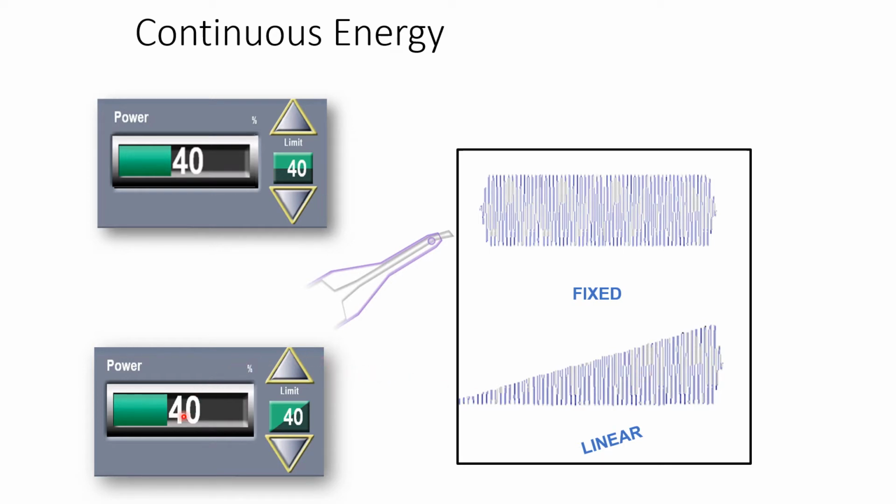If you have chosen 40% phaco power, then that is the maximum you get. You can set in the panel what you want to achieve at the end of foot switch position 3 in linear mode. If you set 40%, then at the end of foot switch position 3, you will get 40% of that stroke length. If you have set 50%, then at the end of foot switch position 3, you will get 50%. But in the start, you get 1%, 2%, 5%, 10%, and as you go deeper, you get more and more power.